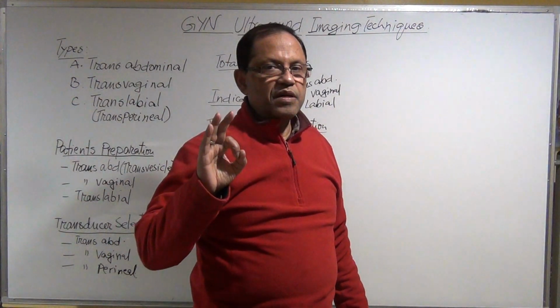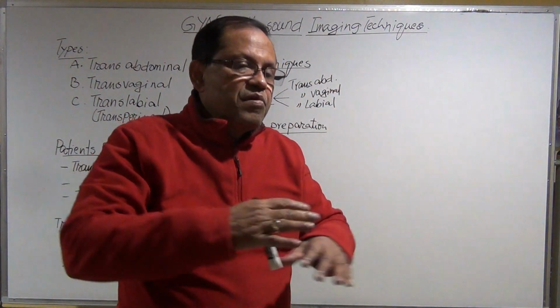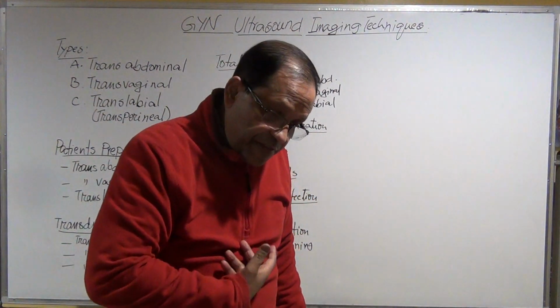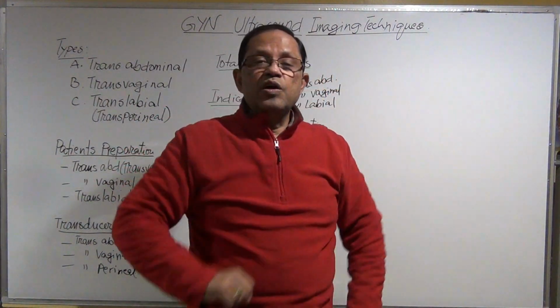This is important. So now, how will I fill up the bladder? Is it drinking always?